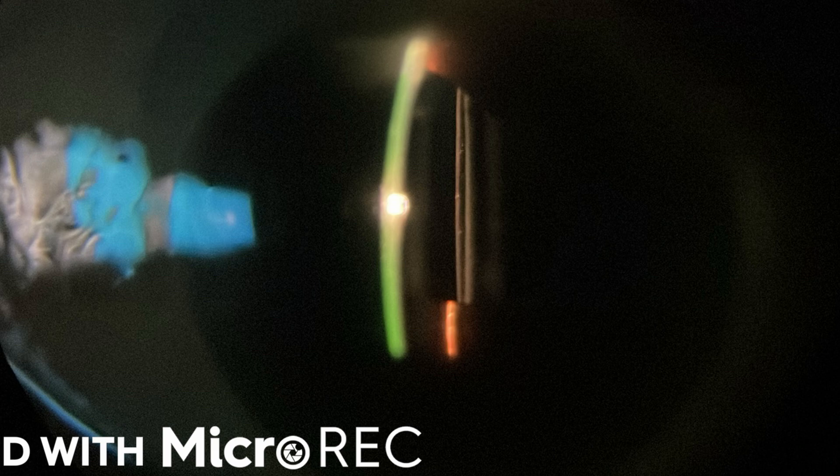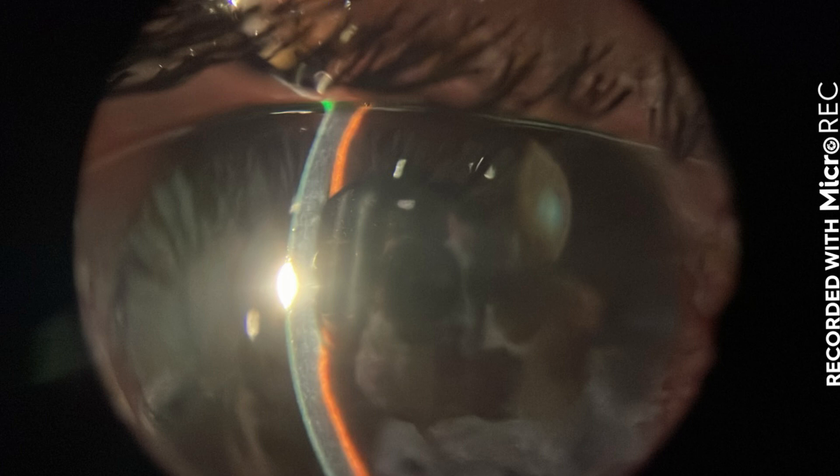Here are a few caveats to keep in mind. Number 1: make sure your anterior chamber is deep enough. If the pressure is elevated due to an angle closure with a shallow AC, this is not the right way to treat it. Caveat number 2: make sure you're going in perfectly parallel to the iris — you don't want to hit the lens, the iris, or the endothelium. For the first time doing this procedure, it's probably best to do it in a pseudophakic eye as you can't damage the lens. If you want to practice beforehand, you can use plastic or animal eyes to do so.